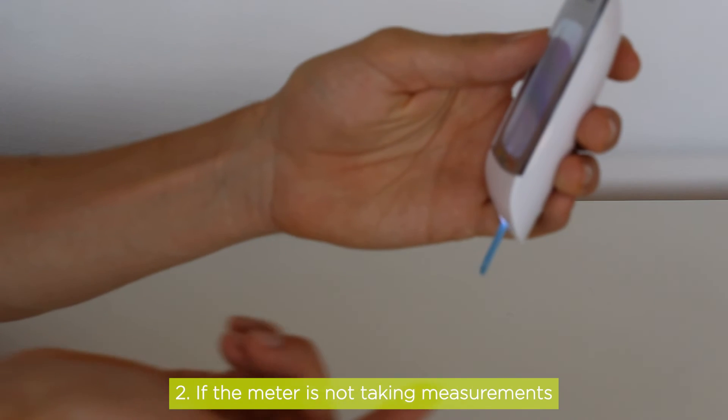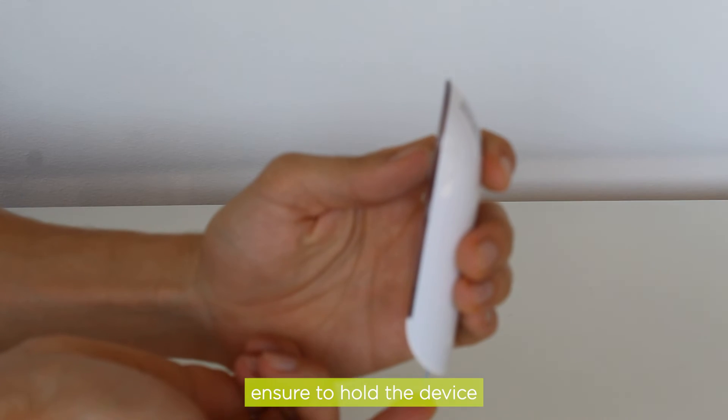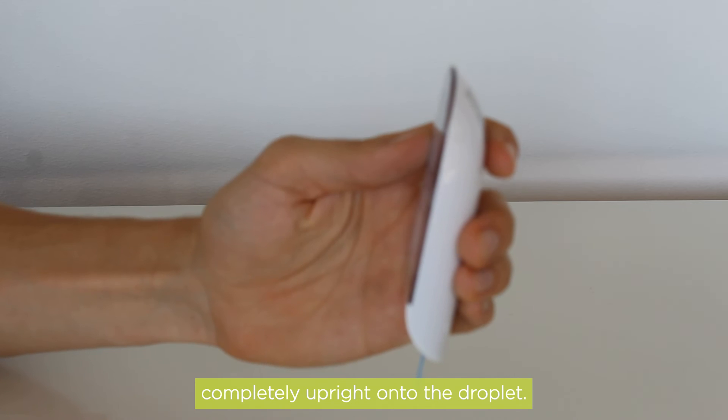2. If the meter is not taking measurements, even after applying the test strip to blood, ensure to hold the device completely upright onto the droplet.